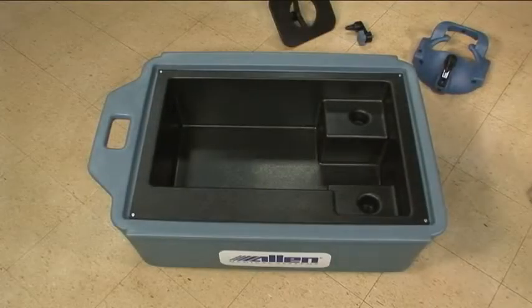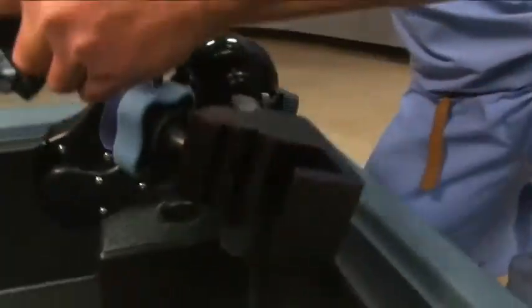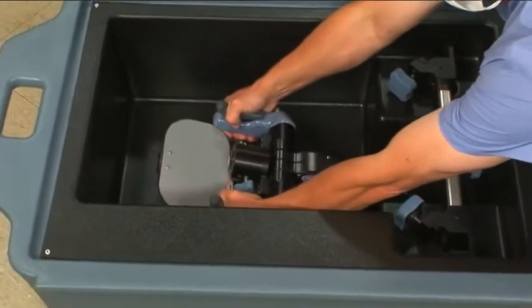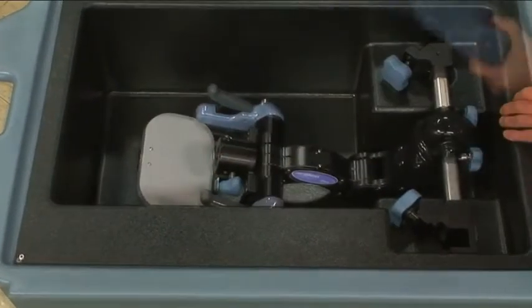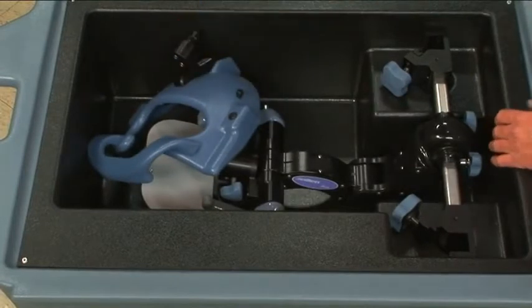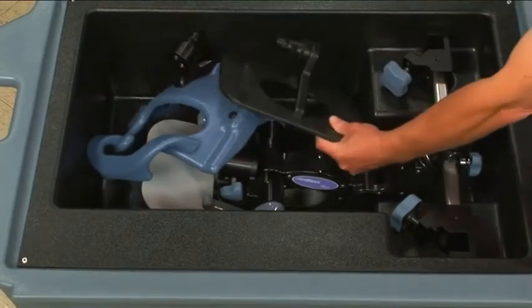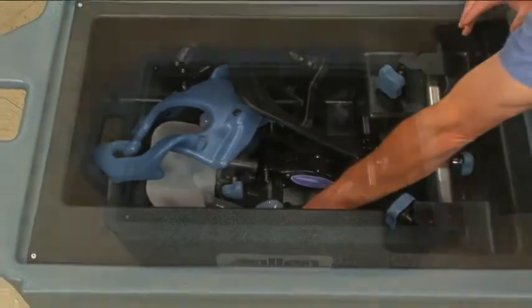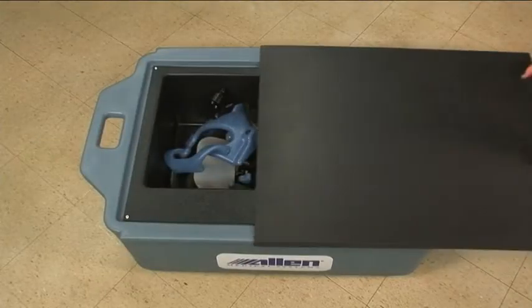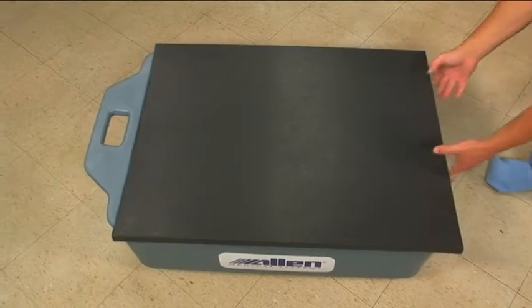The C-flex comes with its own storage case. Align the bumpers on the C-flex with the cups in the storage case. Stretch the C-flex out along the bottom of the case. Place each of the three included headpieces — the prone face mask, the flat plate, and the starburst adapter — into the storage case. Slide the top on and the C-flex is ready to be stored until the next procedure.